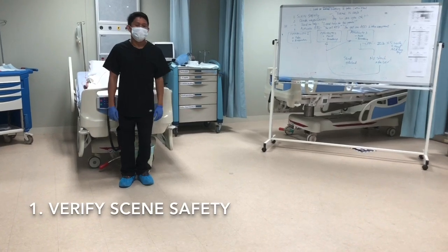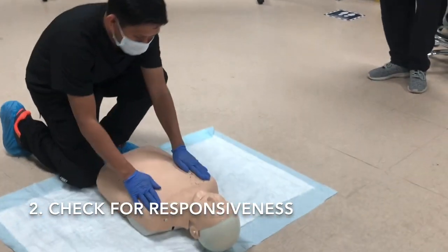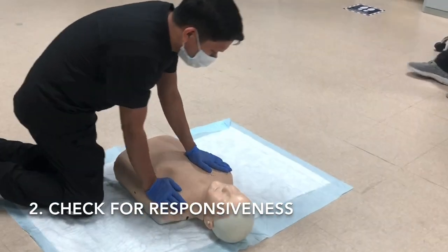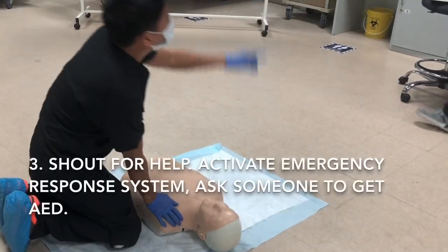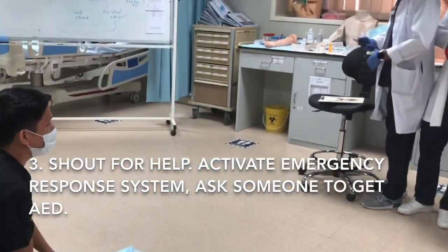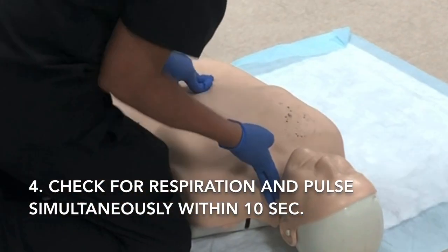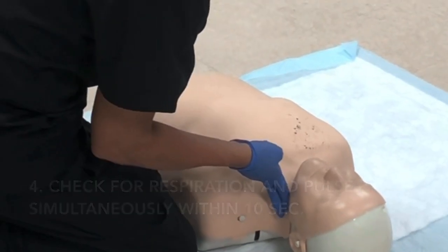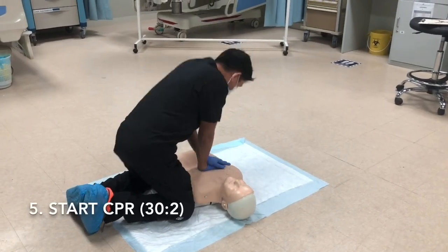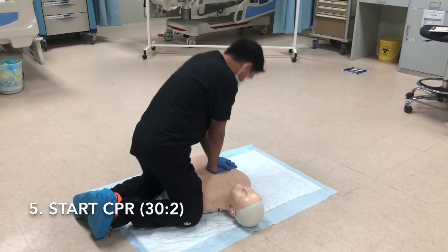I have one victim. Hey sir, hey sir, are you okay? Hey sir, are you okay? Call 997 and get an AED. Checking for pulse and respiration — no pulse, no respiration. CPR.